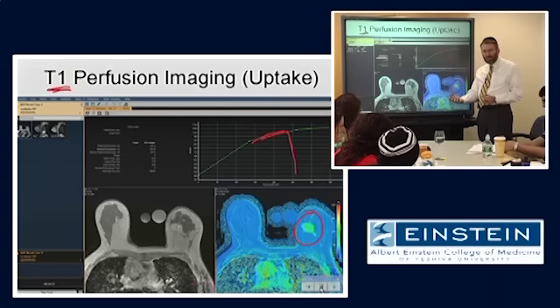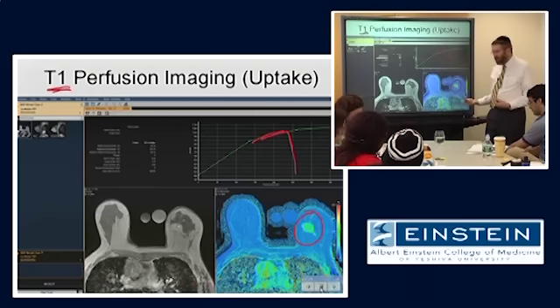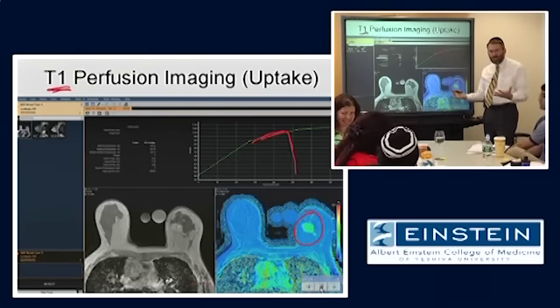When you give a contrast agent, right, and you do a T1 weighted image, the change in the actual signal in proportion to T1 shortening, that happens instantaneously. What it depends on is how long does it take for that contrast to infiltrate in and get up into the object or the pathology that you're interested in looking at.